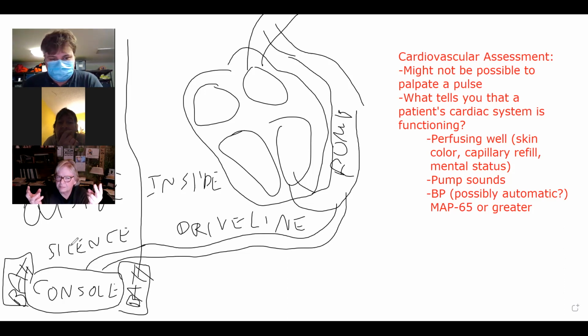And I assume, maybe incorrectly, that a patient is supposed to take one battery out and charge it. So this is someone who's going to have at least 4 batteries, and oftentimes a spare charger and a spare console. So if they've just been negligent or remiss in charging their batteries, what are our options? I mean, how long does it take for one of these batteries to charge?